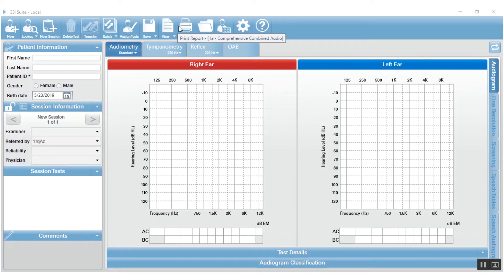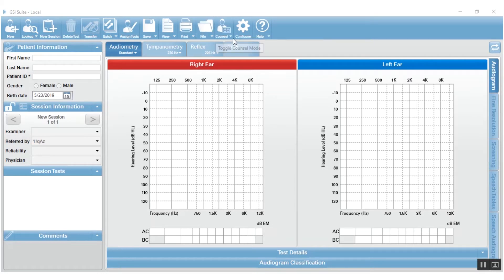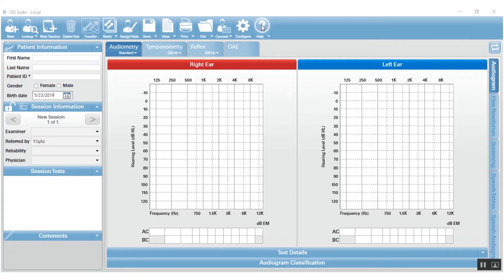And then save, view, print, file. Those are all how you handle the reports after they've been transferred into GSI Suite. Of course, Configure contains a lot of information that helps you manage the data and manage the way that your suite is behaving and help will give you access to both the user manual and also the version of suite that you have loaded on your machine.